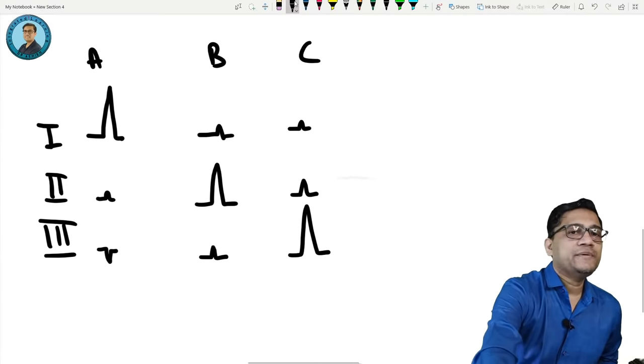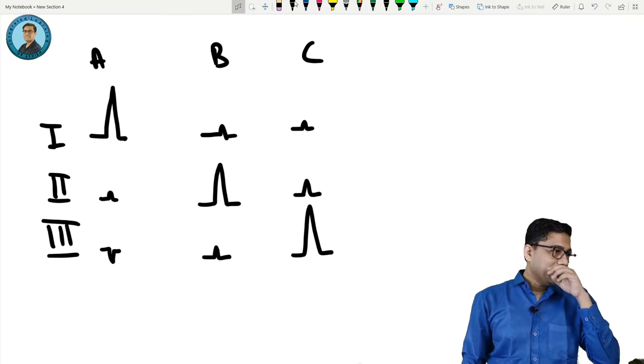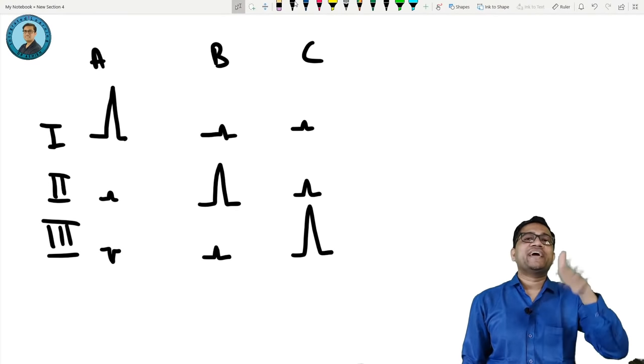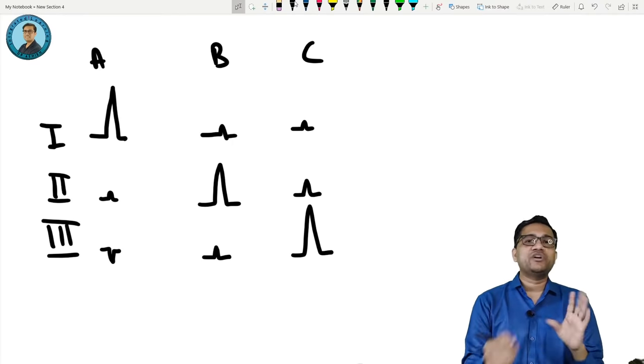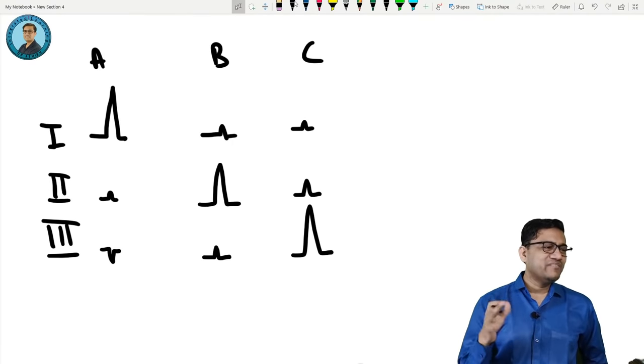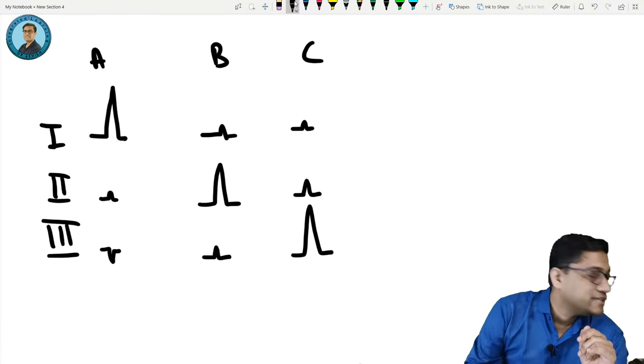So, diagnosis, ABC diagnosis. AVR is just looking at the cavity. It's an inverted lead, called the opposite lead. AVR, ignore. Any minor doubt, leave it. All are right, inferior. So, do the diagnosis, ABC.